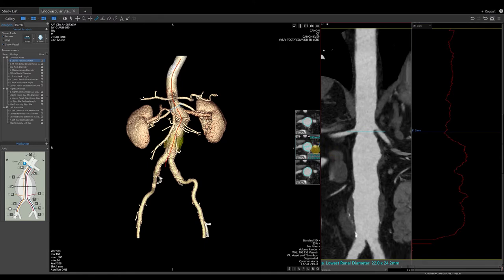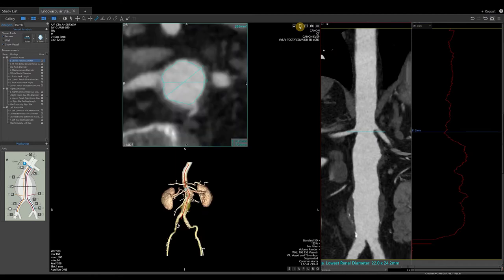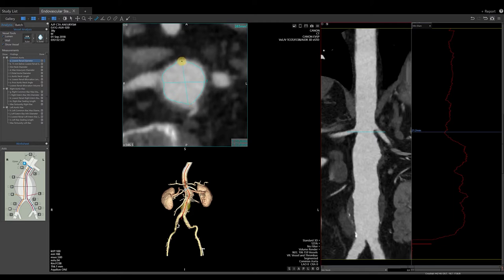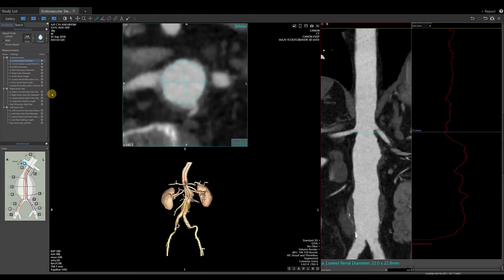Once there, grab the light blue line and superimpose over the dark blue line. To see our cross-axial measurement a little easier, in the upper right-hand corner of our 3D image, select the toggle view button, which looks like three stacked boxes — single left click. This provides a large cross-axial slice image. If you disagree with the measurements placed, hover over one end or the other to change location or length of the measurement. Once you've determined that your measurement is accurate, on our work list, check the box on lowest renal diameter. This will lock your measurement in place and place your findings on the report page.